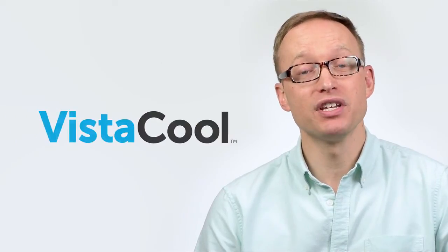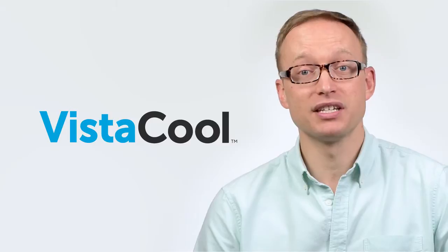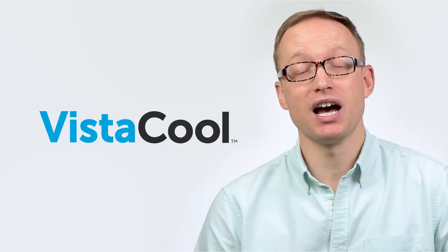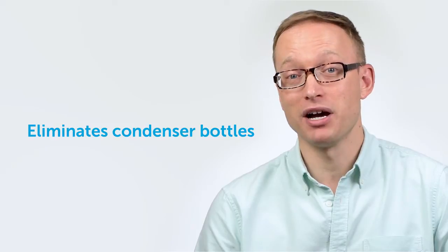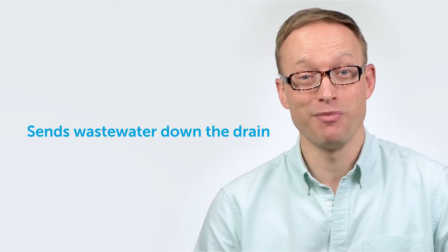Hi, my name is Matt from Vista Research Group, and I'm going to walk you through the installation process for the VistaCool Direct-to-Drain Thermal Reduction System. VistaCool is designed to reduce the high temperature of the condensation discharged from autoclaves, eliminating the need for condenser bottles and tanks, and enabling sterilizer wastewater to be sent directly down the drain automatically.